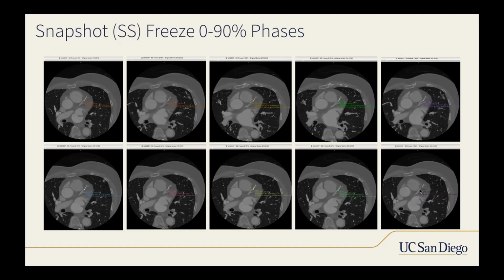And so then the next slide. Between each one of these, are you moving the slice to find which slice that piece of calcium is in? Yes. Okay, so you have to track it in the slice as well. Yes. Yeah, that was the tricky part for all of these cases.